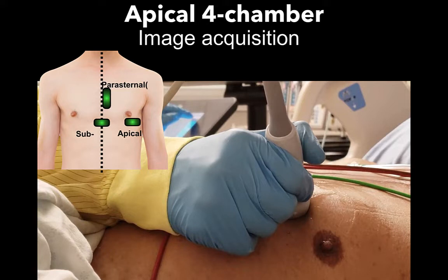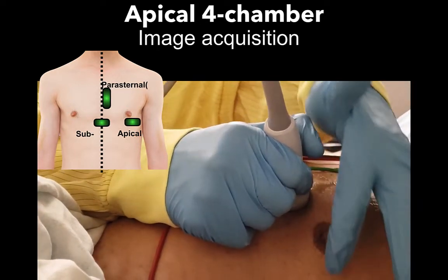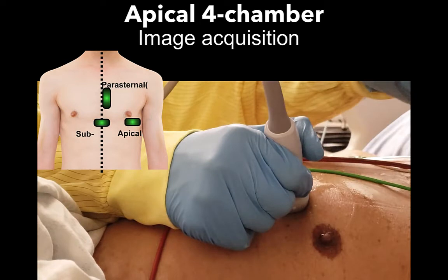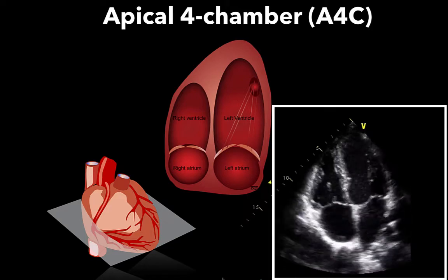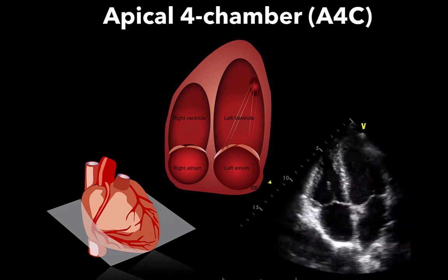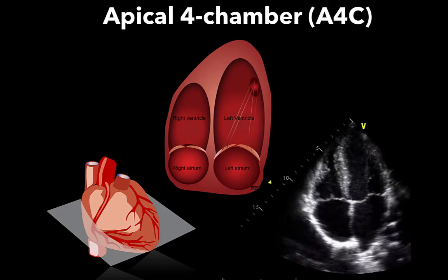Moving on to the apical four-chamber. If you palpate for the apical impulse, you may find the true apex, usually a little inferior and lateral to where the anatomical nipple should be. This is the hardest of all windows, so expect yourself to struggle at first. If your patient is in left lateral decubitus, the apex will shift laterally and be found more towards the axilla. With the probe marker facing the bed and just inferior to the nipple line, you can obtain an apical four-chamber, especially in a supine patient. The view shows left atrium, mitral valve, LV, right atrium, tricuspid valve, and right ventricle. The pericardium also surrounds all four chambers and is seen much more easily in the presence of an effusion. This is a key window to assess LV and RV function and the presence of tamponade or massive structural abnormalities.